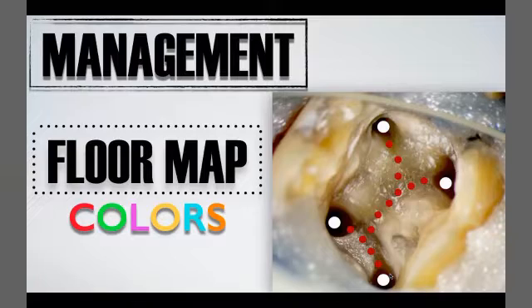And in your opinion, is it possible to manage the pulp stones without a microscope or not? Yes, without a microscope it's possible for small or a little bit bigger pulp stones, while for completely calcified pulp chambers, no, we need a microscope. I agree.